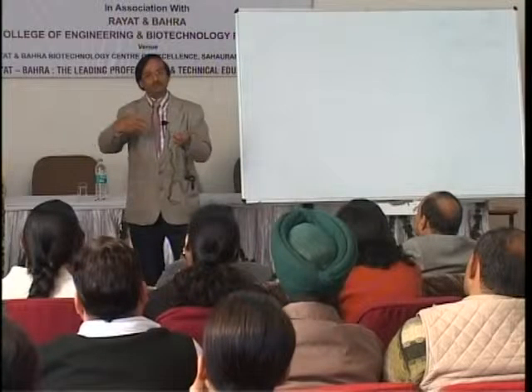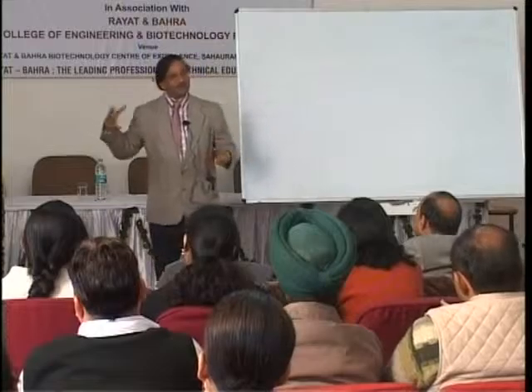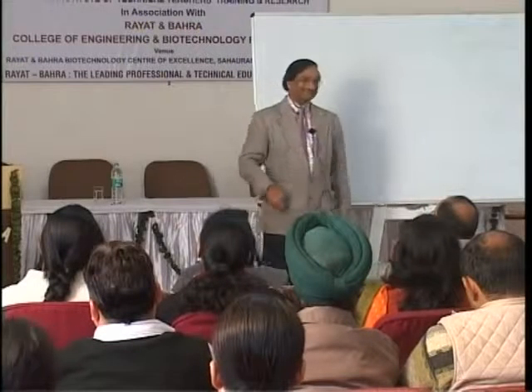And of course, you need many more hybrid scanners. Hybrid scanners means multiple modalities in one unit. Right now, you have PET CT. Probably you need a single machine where you can do ultrasound, you can do PET, you can do MR, and everything.